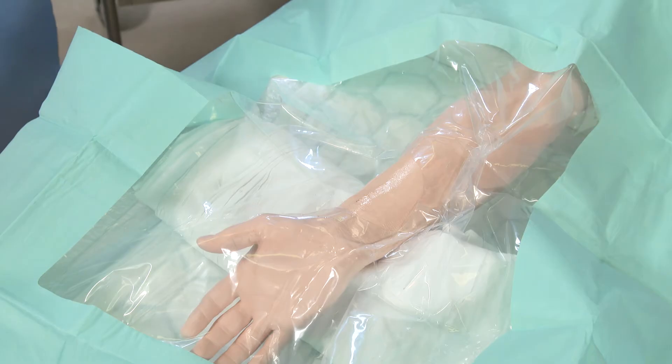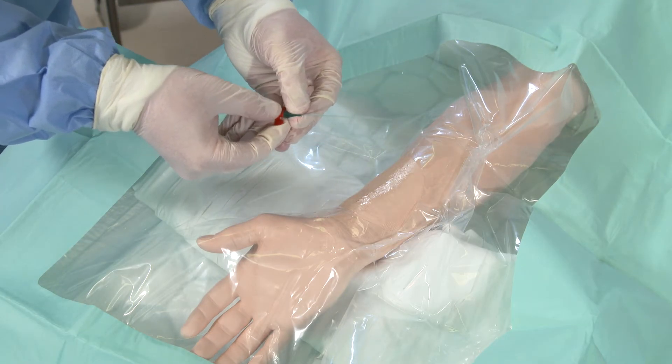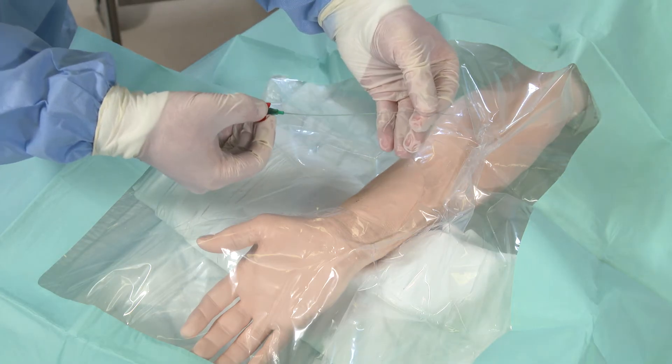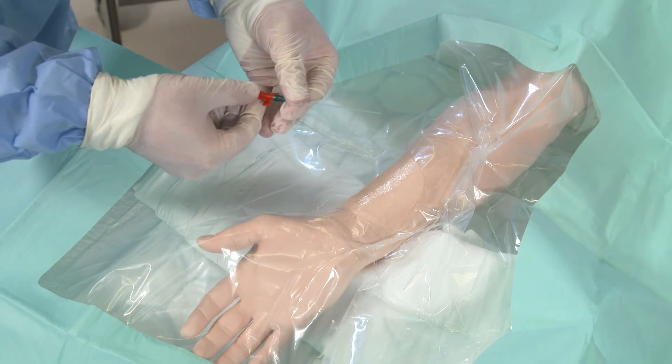Whilst the lidocaine is working you can prepare your equipment. Here we have the line itself with a guide wire inside of it. If you remove the guide wire it will be ready for the procedure.